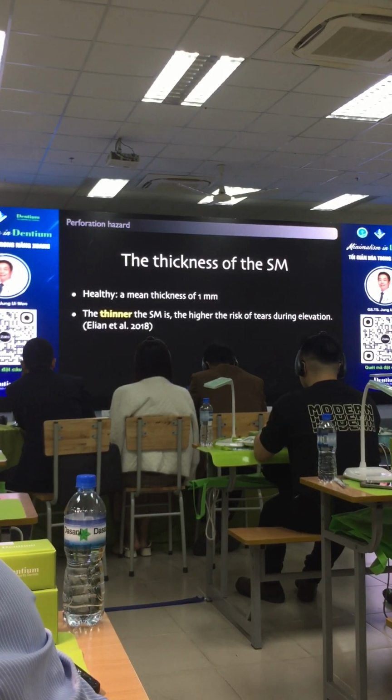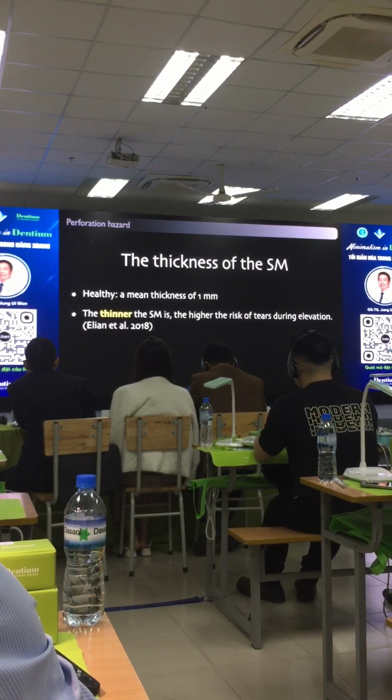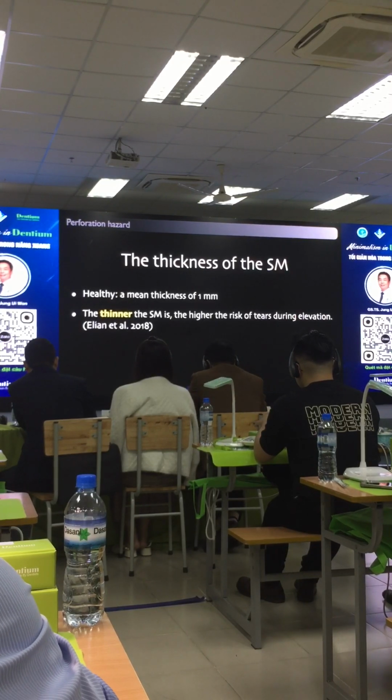Evaluation of the thickness of the sinus membrane is key important to avoid the perforation. The thinner the sinus membrane is, the higher the risk of tears during elevation. In the patient having the thin sinus membrane, special caution is needed.